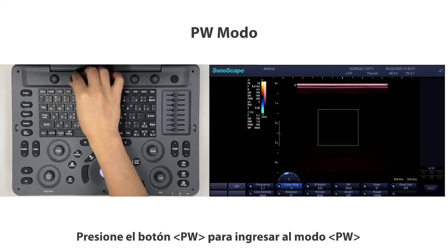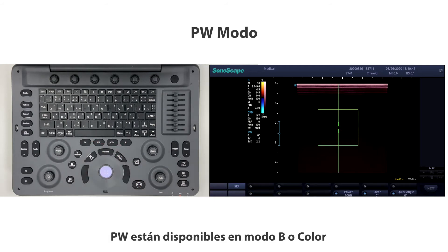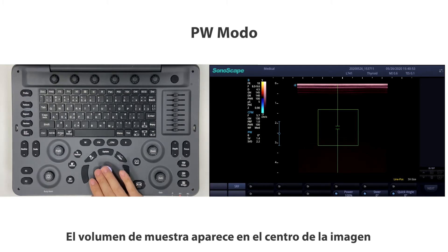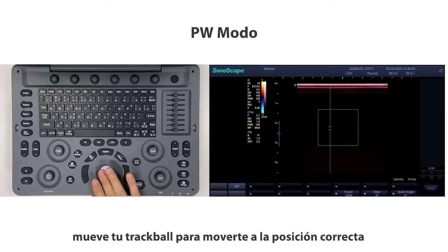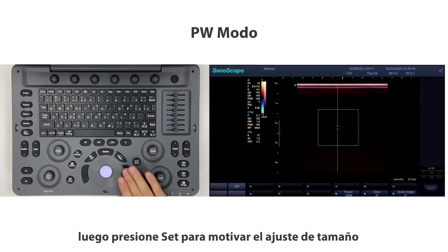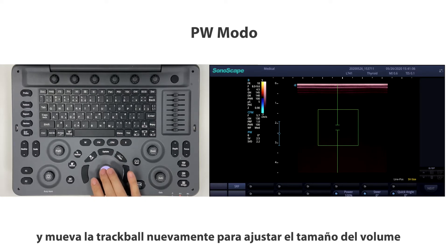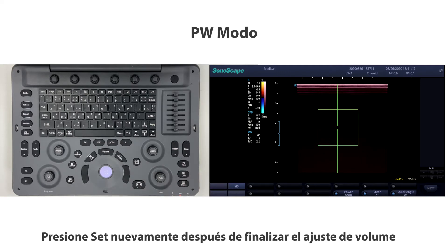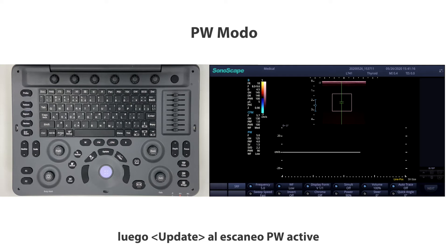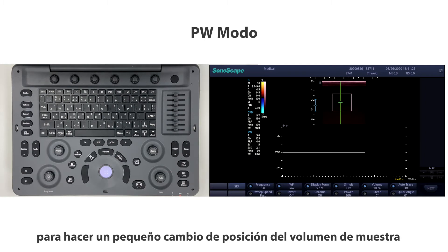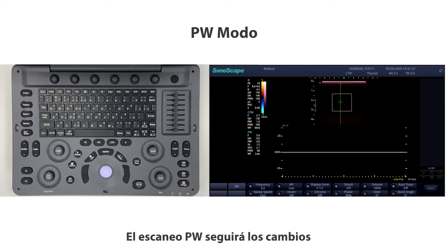Press the PW button to enter PW mode — PW is available in B or color mode. The sample volume appears in the center of the image; move the trackball to position it, then press SET to activate size adjustment. Move the trackball again to adjust the volume size, press SET to confirm, then press Update to activate PW scanning. You can still move the trackball to make small position changes and PW scanning will follow.